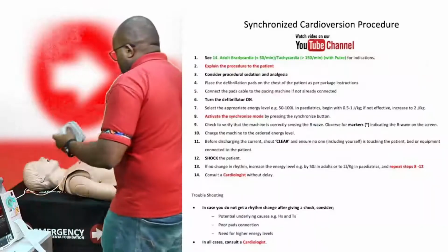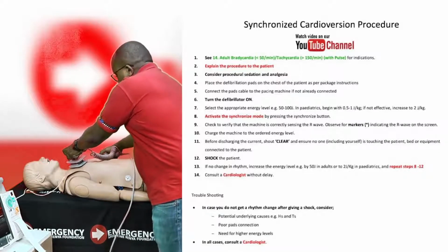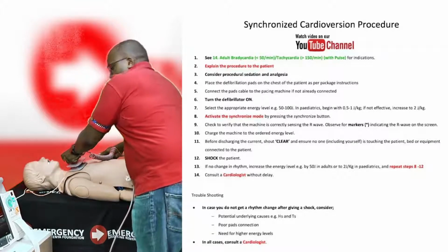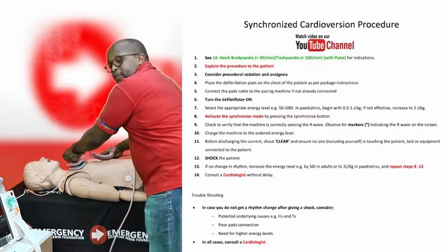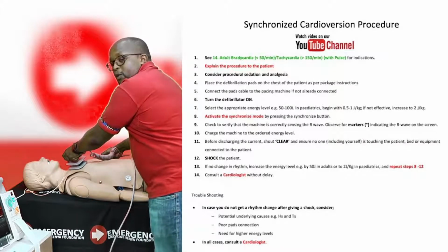All right, Mr. John, I'm going to shock you a bit. Okay, I'm ready. Remember, I'm going to charge and make sure everyone is clear, and then shock the patient. Normally it's painful. The patient will probably scream and shout at this point, which is perfectly fine. Now I notice my rhythm has not changed, so I'm not going to come out of here.